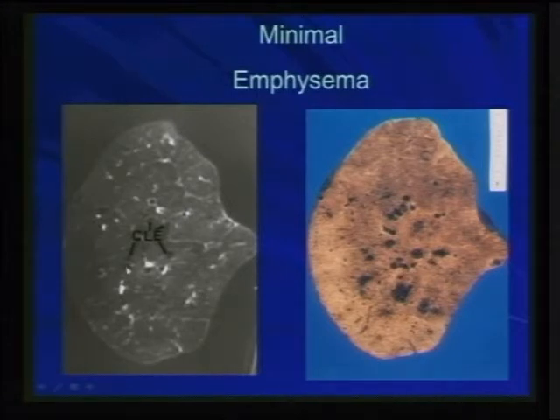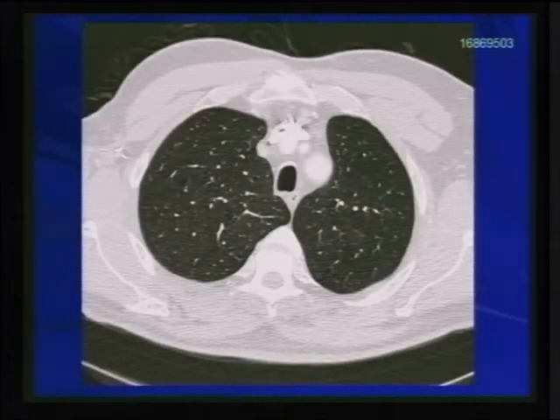I have to say that in a smoking cessation program, I think the best probably motivator or the best deterrent is showing the patients their actual lungs, and that has probably had more impact on having the patient basically realize that there is damage to their lungs, and that's where they stop. In my own experience, when you show these areas of pulmonary emphysema to the patient, that had more impact than actually going through those other programs. And this is when we start doing this lung screening, especially in the patients that are heavy smokers.